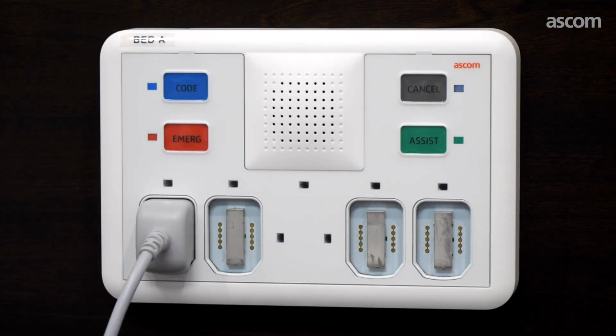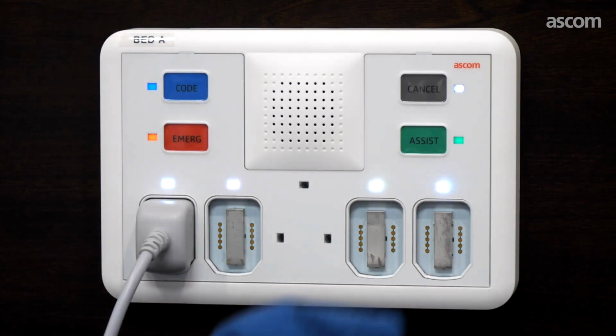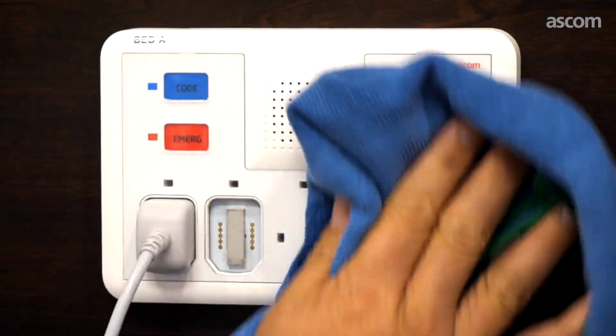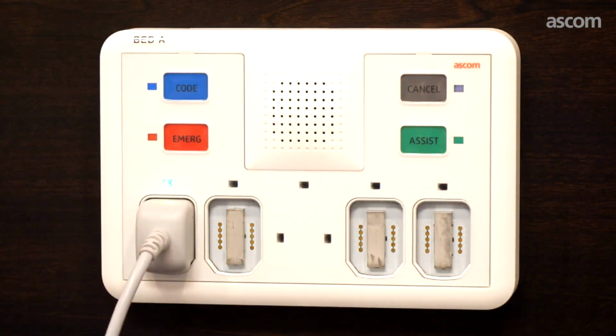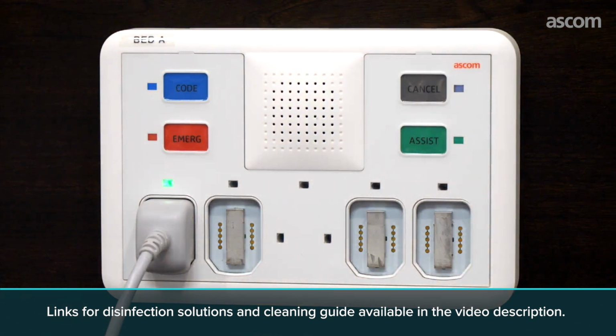All LEDs on the patient station and any modules attached to it will fast flash to indicate it is in cleaning mode. Gently wipe the surface of the station with a damp cloth. Clean any associated cords using a damp cloth. After 15 seconds, the devices will automatically exit cleaning mode and the LEDs will stop flashing.